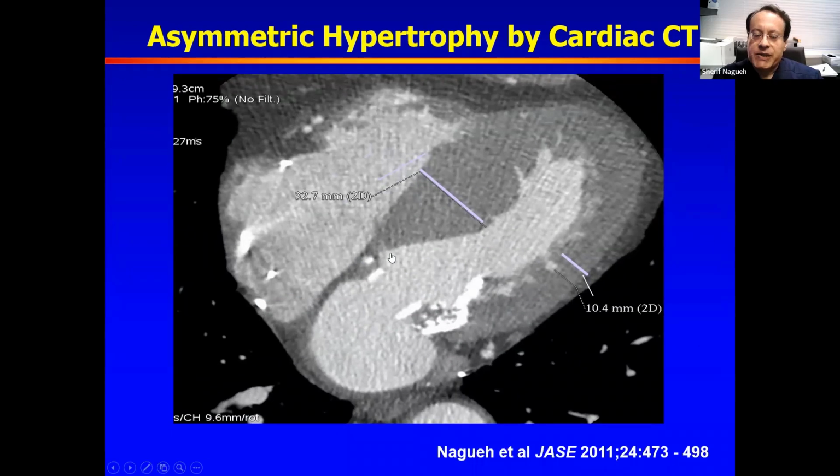Sometimes we have patients who cannot go through CMR. For example, they have an ICD lead from an older generation. Nowadays, we do not really encounter much of that concern. Or somebody who's claustrophobic and cannot go through the CMR despite the use of minor tranquilizers.